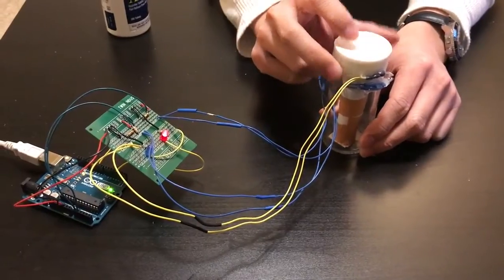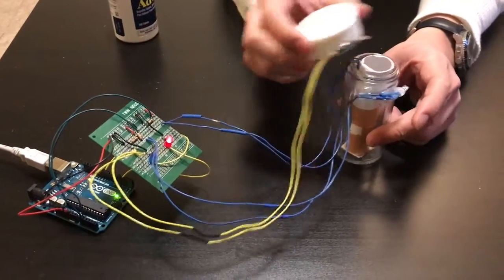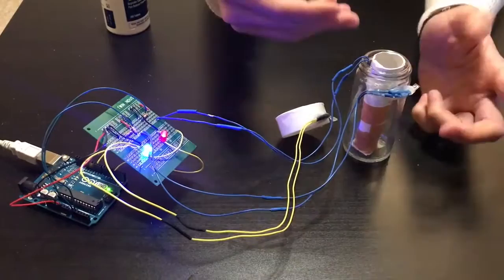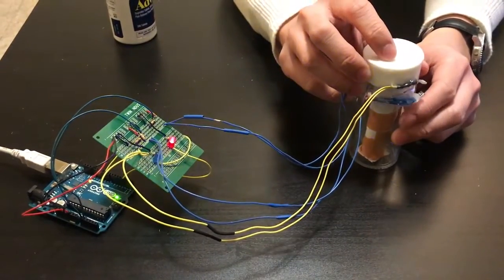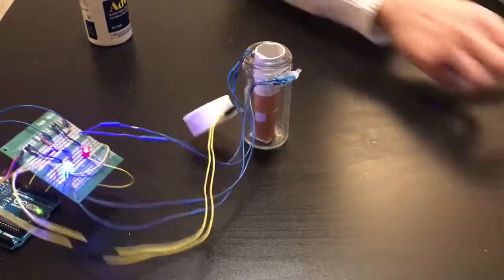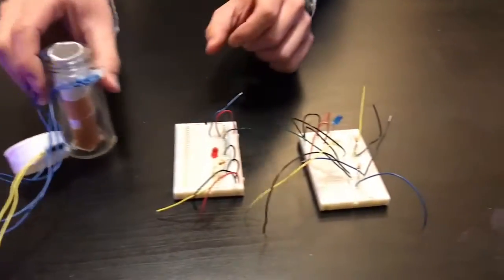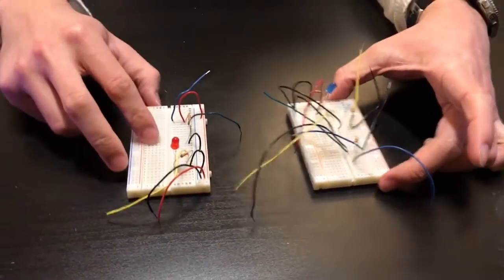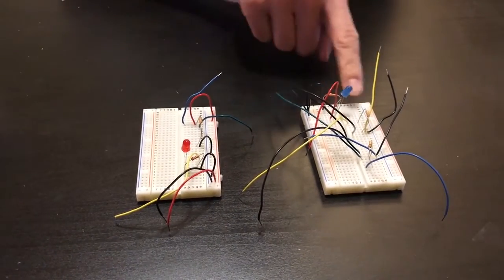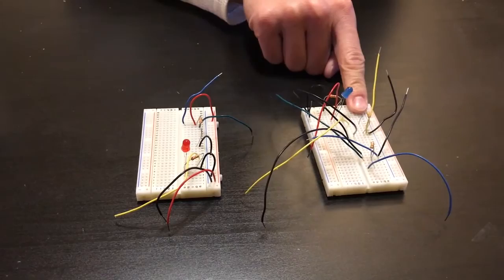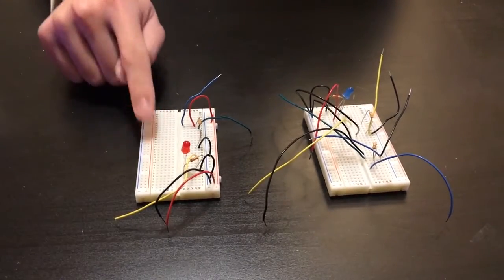So how our smart pill bottle works is essentially we have two core components. We have the pressure sensitive resistor and also the IR receiver and emitter. These are the two core circuits of our entire device.